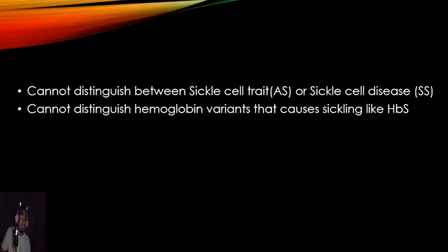Now, what we do here in our laboratory, for your information, is hemoglobin studies. We either run it through an electrophoresis machine if the physician wants the actual peaks of the different hemoglobin molecules, or we can do high performance liquid chromatography, which is another form, if they just want a quantitative analysis of the patient's hemoglobin variants.